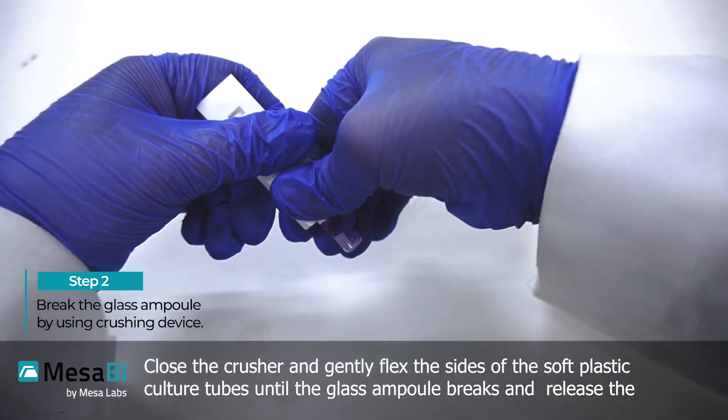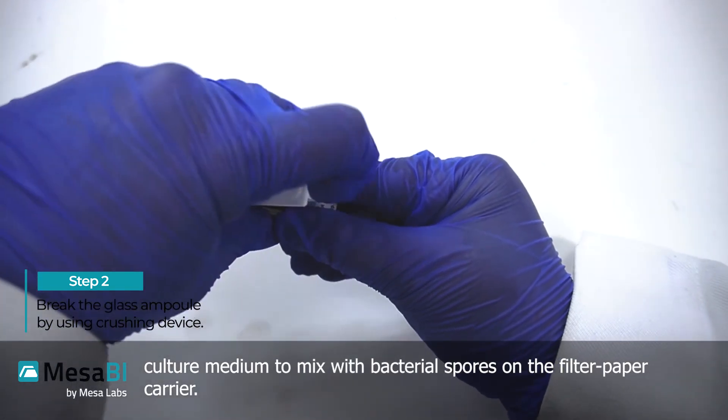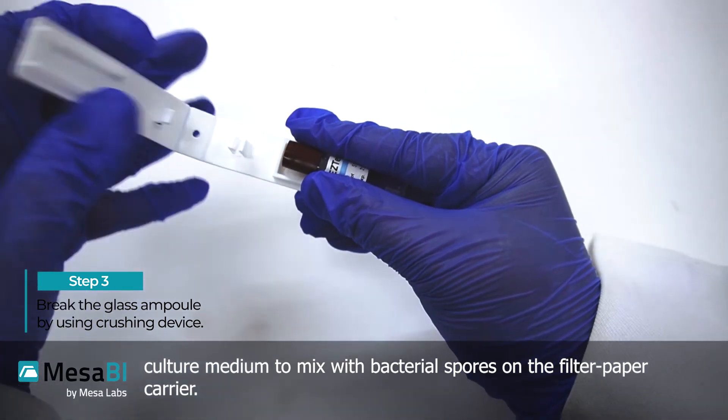Flex the sides of the soft plastic culture tube until the glass ampule breaks and releases the culture medium to mix with the bacterial spores on the filter paper carrier.